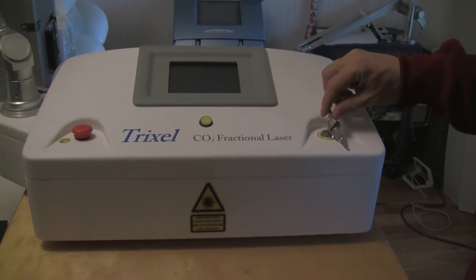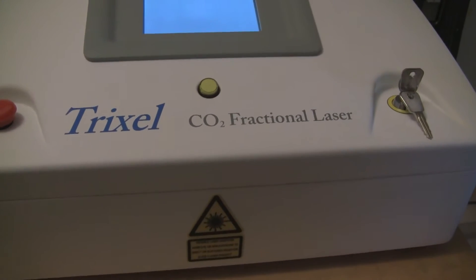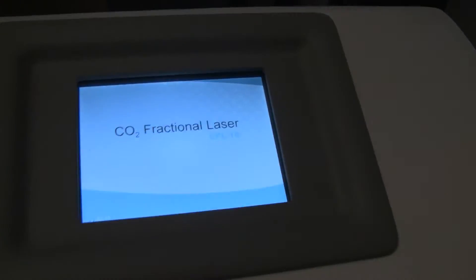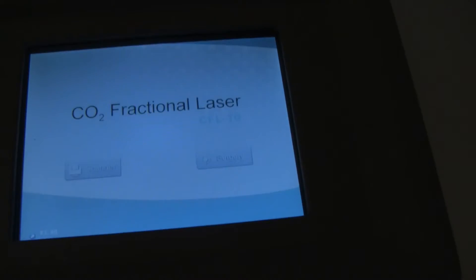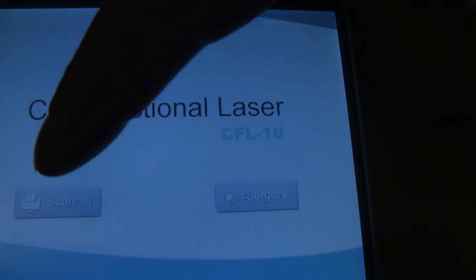This is the Trixel CO2 fractional laser. I'm going to go ahead and turn it on. You have the scanning mode and the surgery mode. We're going to go ahead and select scanner.